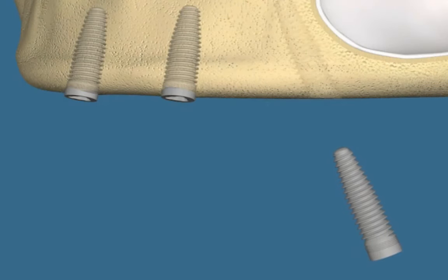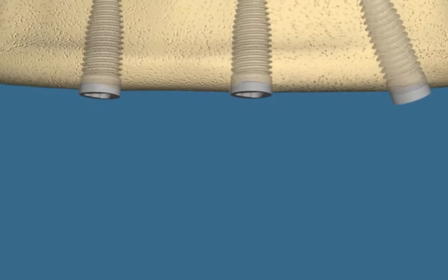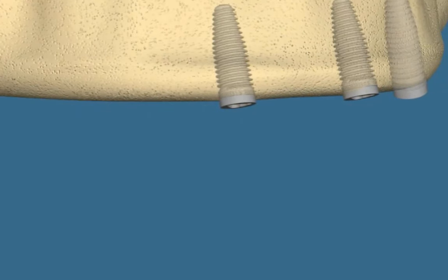But by spreading the implants as far apart as possible, and by placing the most posterior of those implants at an angle to avoid the sinus, we see how this implant-retained arch can become a reality.